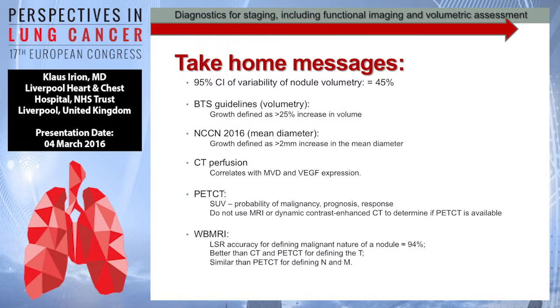If you want to use the guidelines, you need it to show more than 25% growth. You are telling that 1 in 4 of the nodules has growth. When you use our software, you are going to be over-diagnosing growth. You'll be interacting with those patients, which may be justifiable because you don't want to miss lung cancer in the treatable phase, but you need to be aware, and your clinicians need to be aware of that.